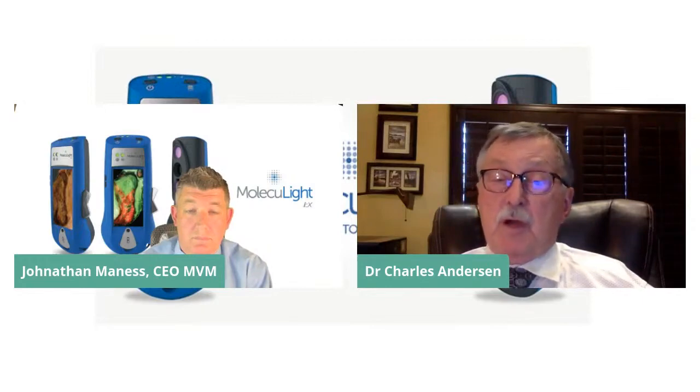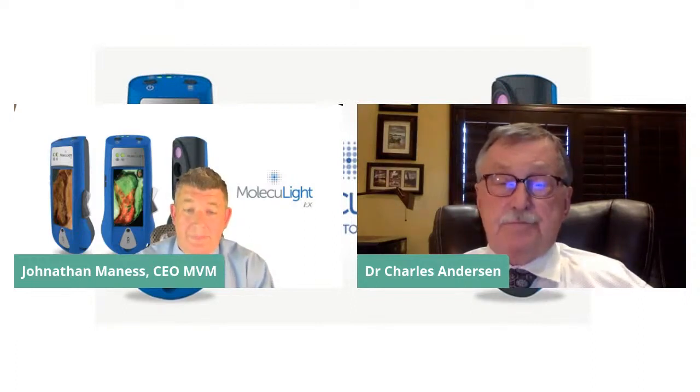If you have an ulcer and you leave a colonized ulcer, for example, put them in a dressing and they go away for a week, oftentimes they will come back, and that bacterial burden now has led to significant infection, an acute infection. They have to go to the operating room for more of a debridement. So being able to detect the bacteria early, appropriately manage that bacteria, is a significant adjunct in preventing amputations. It's a game changer. Outstanding.